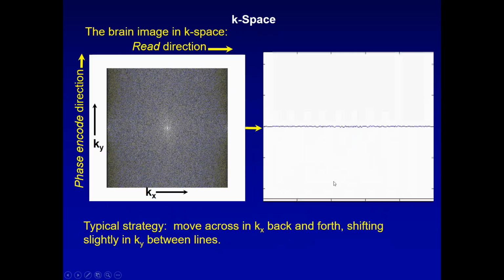Instead of just one line of K-space, we sample over and over. First thing we'll do, say for an echoplanar image, is to drive down, turn on the negative x and the negative y gradients. Turn gradients to negative values for x and y. And that puts us down in a corner of k-space.